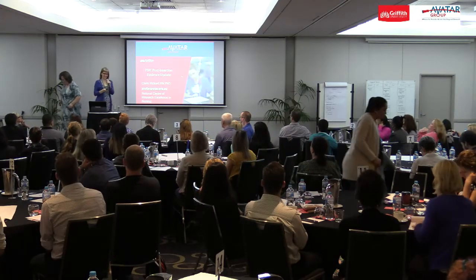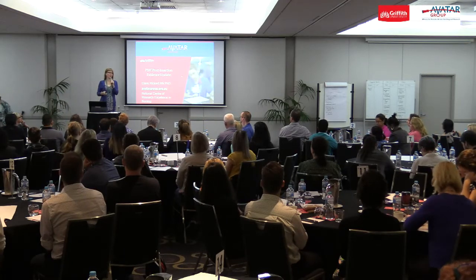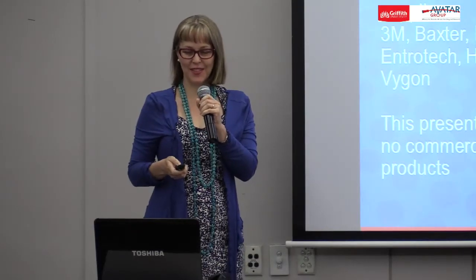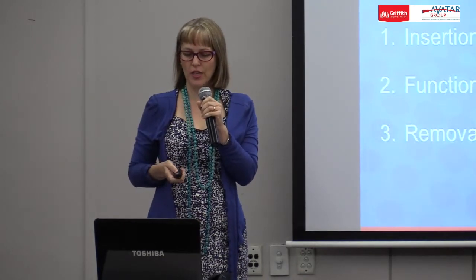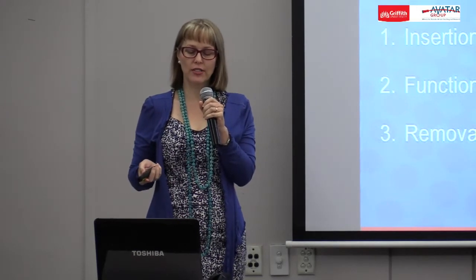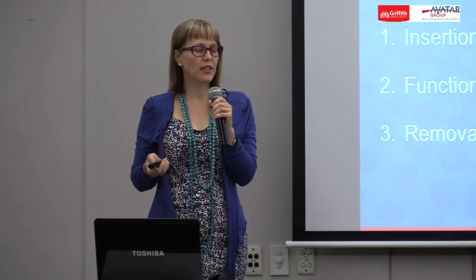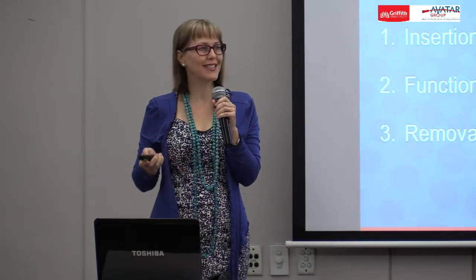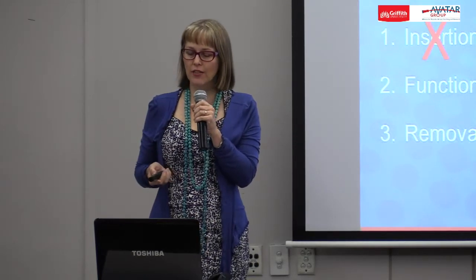Thanks very much, Kay, and thanks, Evan, for that. So I've got 20 minutes to cover everything you need to know once the IV's in, and some of my disclosures again. Obviously we talked about that cycle: decide on the device, insert the device, keep it functioning, and then remove it. And now that we know PIVs can be used beyond 72 hours, really our goal with PIVs is that if a patient is going to have a PIV, they just need one, but it needs to keep working. That's our problem.